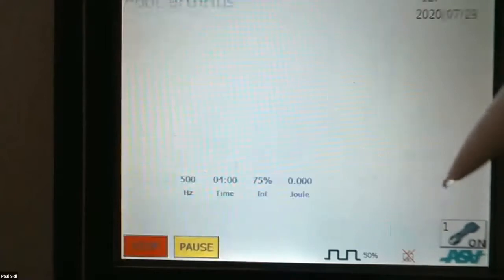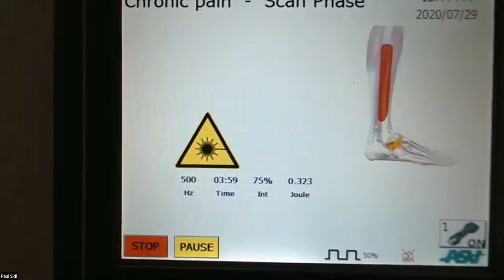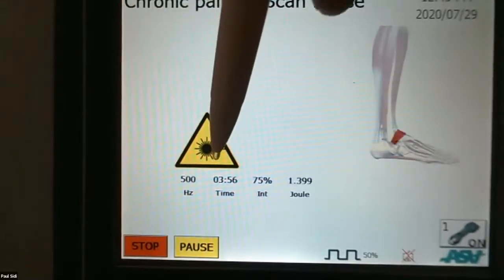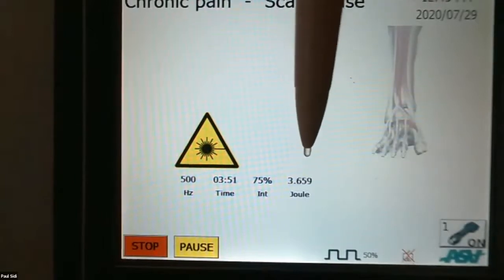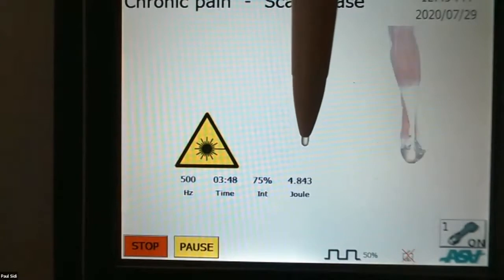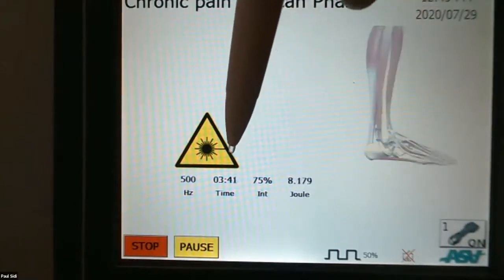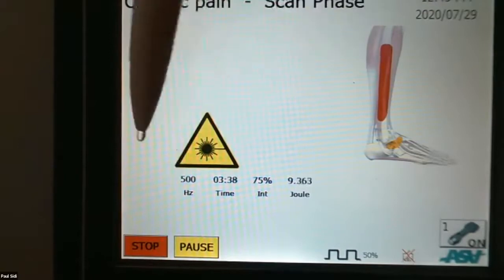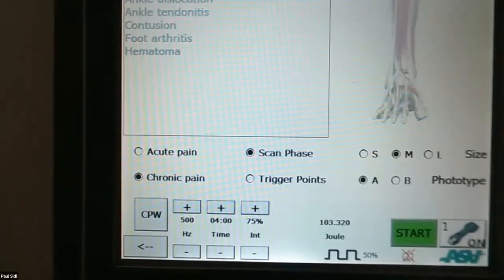All you do is you start this, press the button on the laser, on the wand, and it's only 4 minutes, 3 minutes 56, it's counting down, it's counting up the joules. You're not getting joules per square centimetre because you're not holding this still, therefore it can't tell you exactly how many joules per square centimetre it is. We're just putting a total load of joules into that whole area. Okay, and that will count down until it gets to 0, and it will just stop. So basically, I've done 5 minutes and 4 minutes, 9 minutes, and I've treated the sesamoiditis in a pretty chronic situation. And then I do my other stuff.